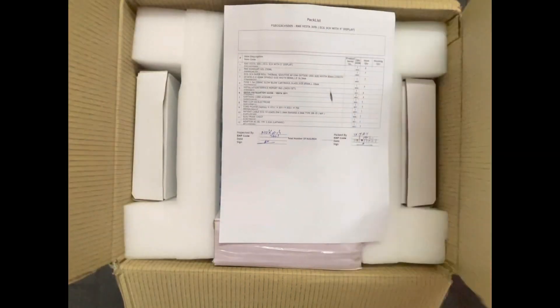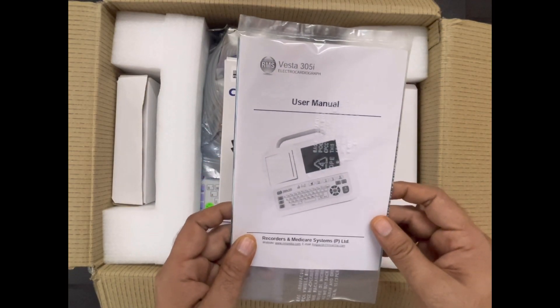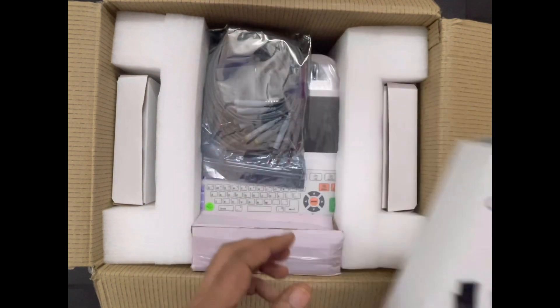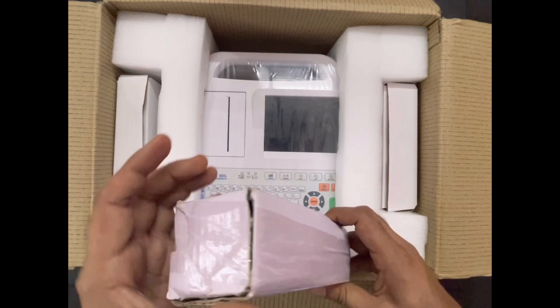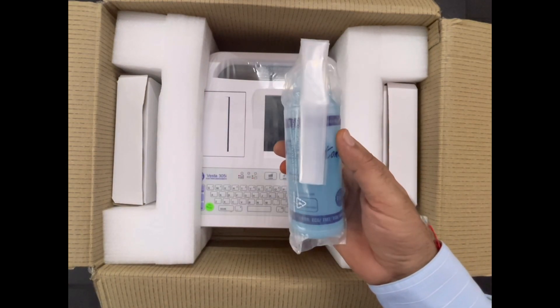Now after opening the box, we will get 1 pack list, 1 ECG user manual, 1 clamp electrode set of 4 numbers, 1 15-pin ECG cable, and 1 ECG gel bottle of 250 ml.